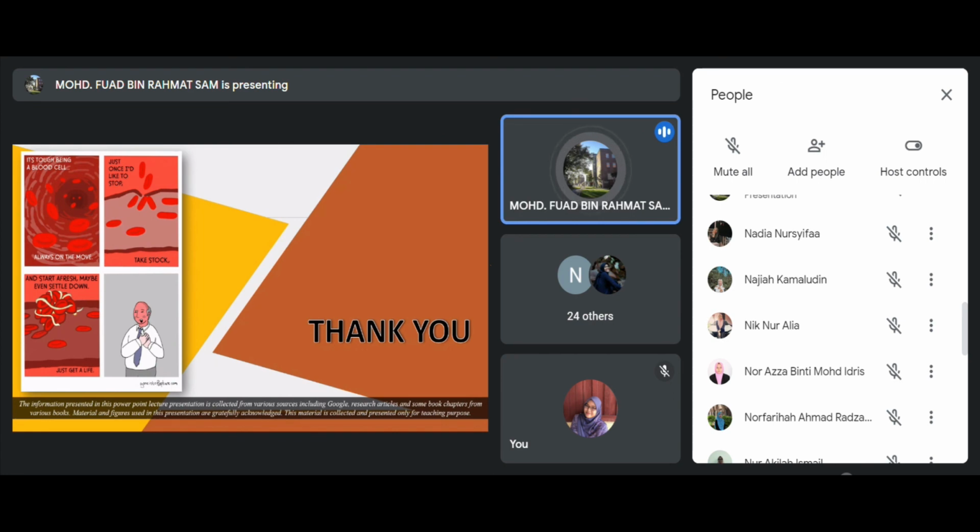Okay, don't forget about the mixing study or correction study, which involves the patient's plasma at a ratio of 1:1 with normal plasma. If corrected, there is a certain interpretation. If not corrected, there is a certain interpretation. Okay, alright. I think that is all for today's session.